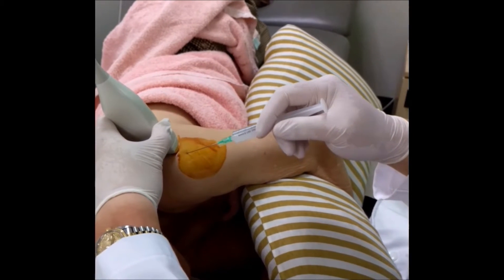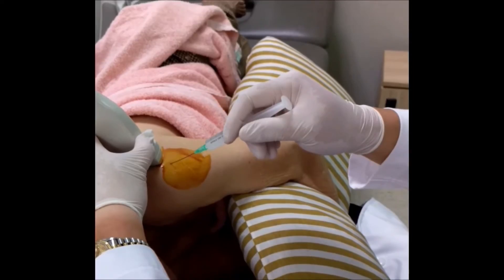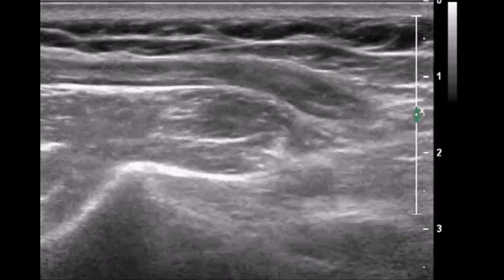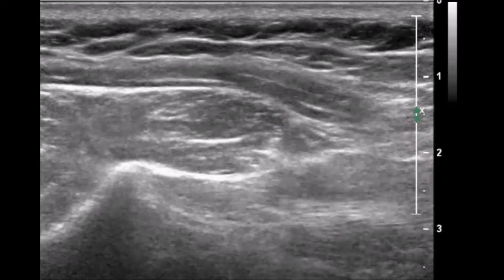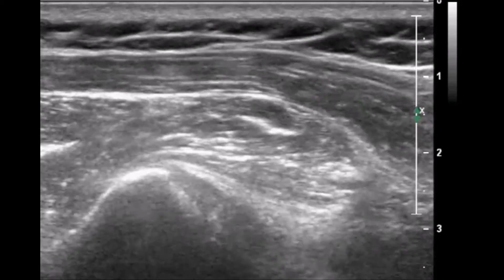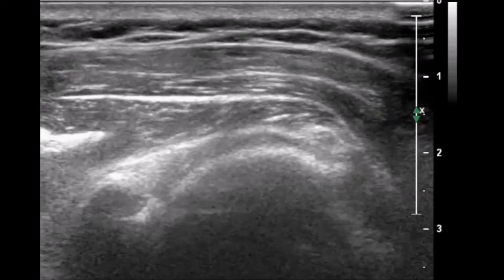The transducer is aligned in the long axis of the musculotendinous junction of the infraspinatus muscle, inferior to the scapular spine. It is important to move around the transducer to find the correct injection spot. The teres minor muscle is located inferior to the infraspinatus muscle and must not be injected.